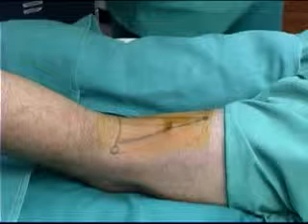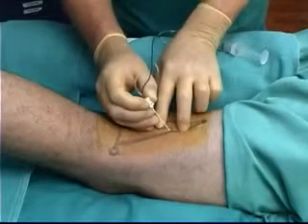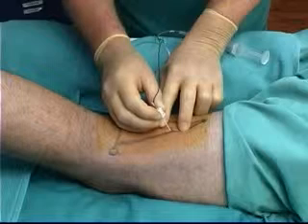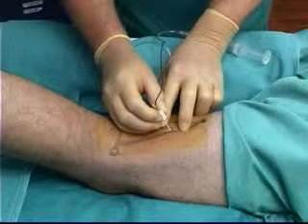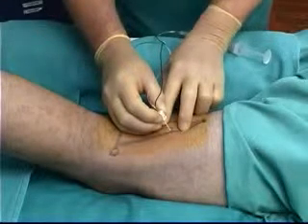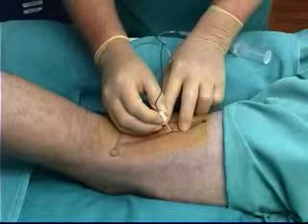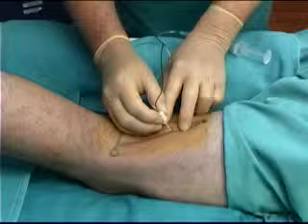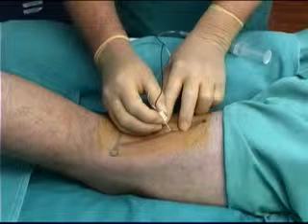The skin and subcutaneous tissue are anesthetized after skin disinfection. A 22-gauge 50 to 100 millimeter stimulating needle with a B bevel is attached to a nerve stimulator set at an output of 1.0 to 1.5 milliamps, 2 Hz frequency, and a pulse width of 100 to 300 microseconds. The needle enters perpendicular to the skin and is advanced anteriorly until the sciatic nerve is encountered.